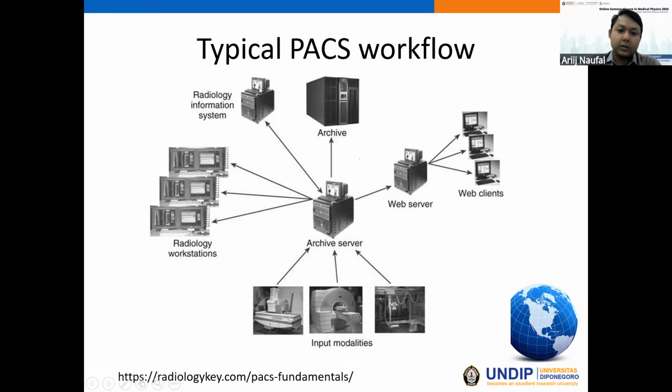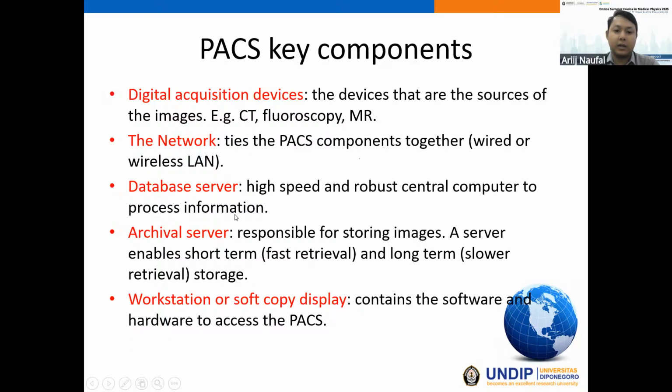The server is also connected to the radiology information system, mainly to record many examinations, and to the workstation, and these are the input modalities where the radiologist exposes patients. After exposing patients, the images can be stored directly to the server, and the server will put the images into the archive, just like that.